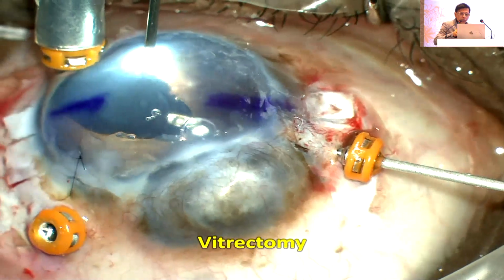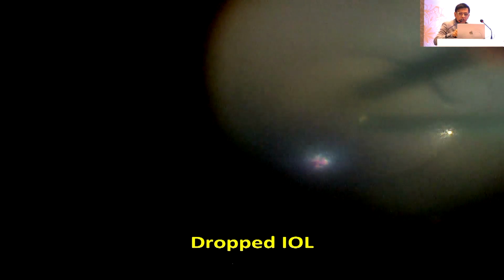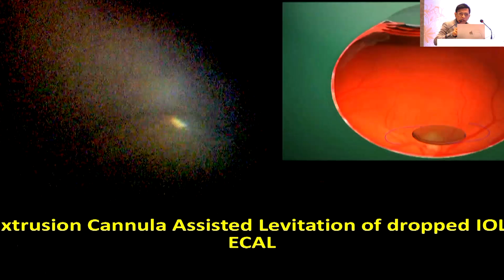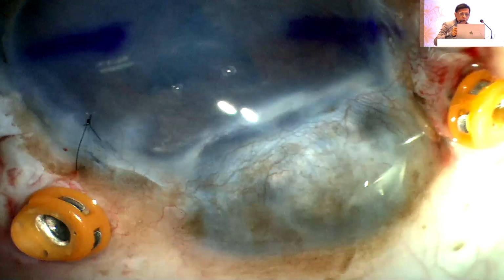So I go ahead and do my vitrectomy, and the technique we use is the ECAL, which was started by Ashwin, basically. Through that hazy cornea, you can see that single piece, non-foldable IOL lying inside. We use the cannula, extrusion cannula assisted levitation after vitrectomy, using the suction, pull it up, shift to a glued IOL forceps. So I've done that.